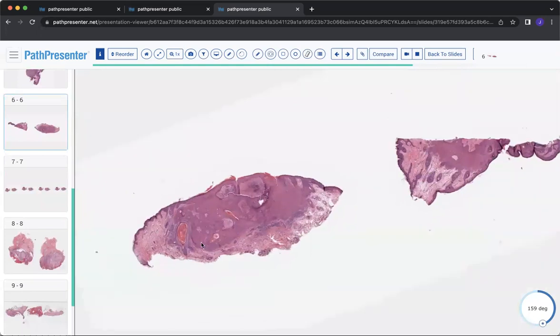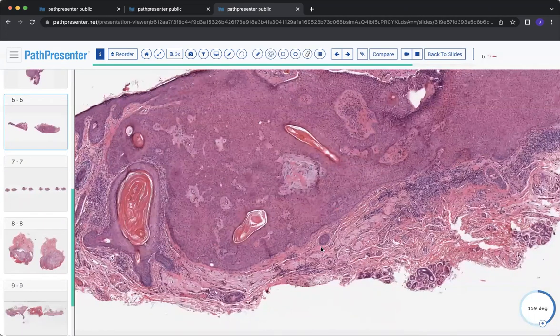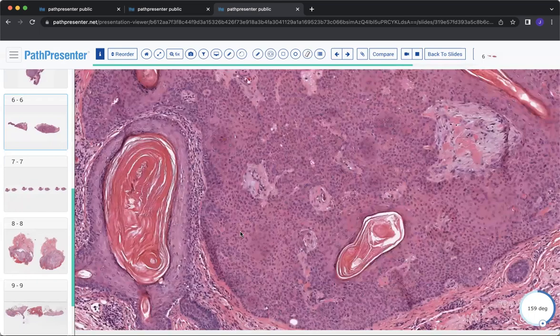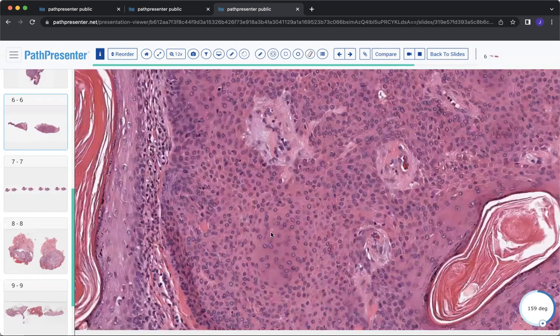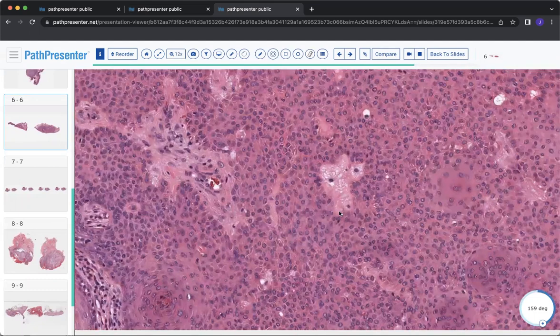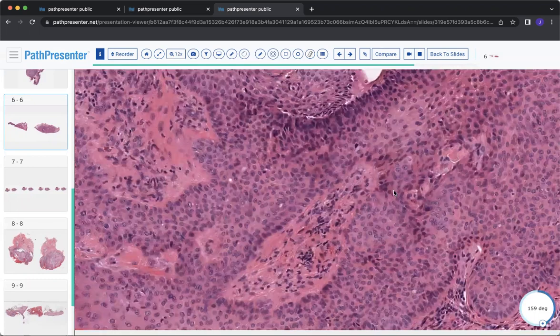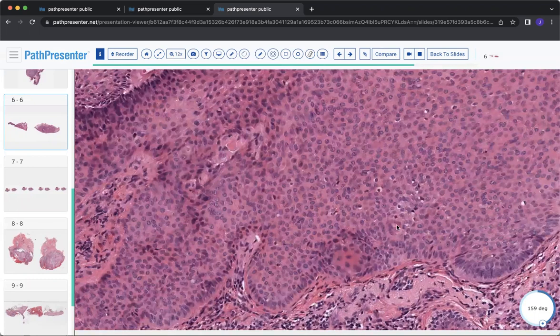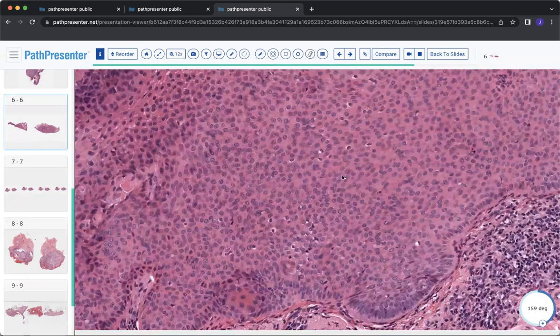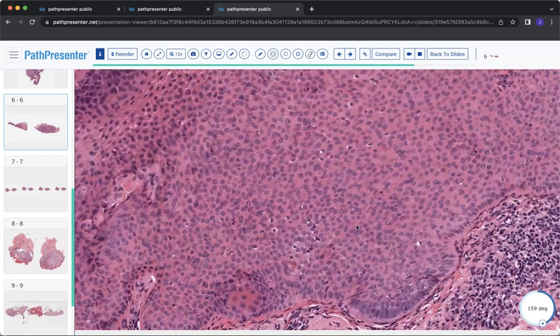Moving on to the next example here. So you have this really well circumscribed neoplasm. It's composed of pretty monotonous cells. Most of the cells actually have eosinophilic cytoplasm. You don't see a ton of clear cells in this example of a tricholemmoma. So this is another example of a tricholemmoma that's got much lower amounts of clear cells, but there's still some clear cells. It's very monotonous.